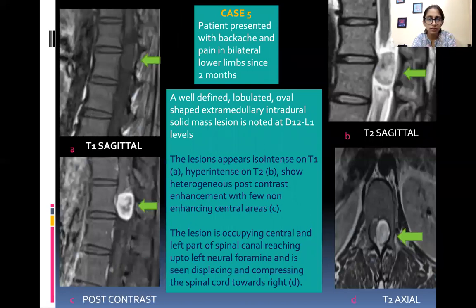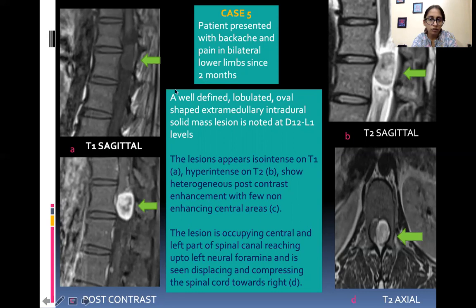Presenting a case of schwannoma: patient presented with backache and pain in bilateral lower limbs since two months. A well-defined lobulated oval-shaped extramedullary intradural solid mass lesion is noted at D12-L1 levels. The lesion appears iso-intense on T1, hyper intense on T2, and shows heterogeneous post-contrast enhancement with few non-enhancing central areas. The lesion occupies the central and left part of the spinal canal, reaching up to the left neural foramina, displacing and compressing the spinal cord towards the right side.